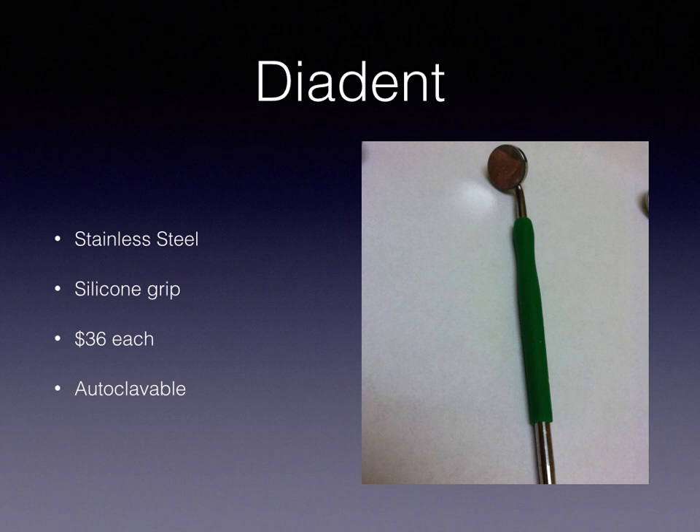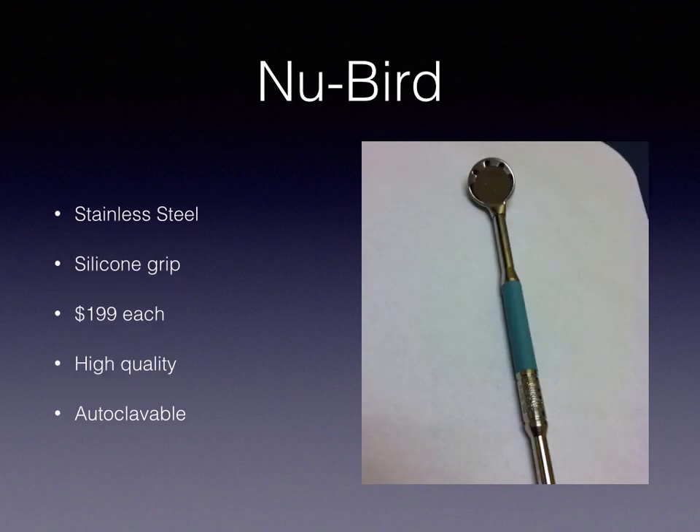The Diodent is a stainless steel suction mirror with a silicone grip. These are about $36 apiece and can be autoclaved. The third product, a relatively new one on the market, is the New Bird suction mirror. It's also made out of stainless steel with a silicone grip, and it's $199 each.